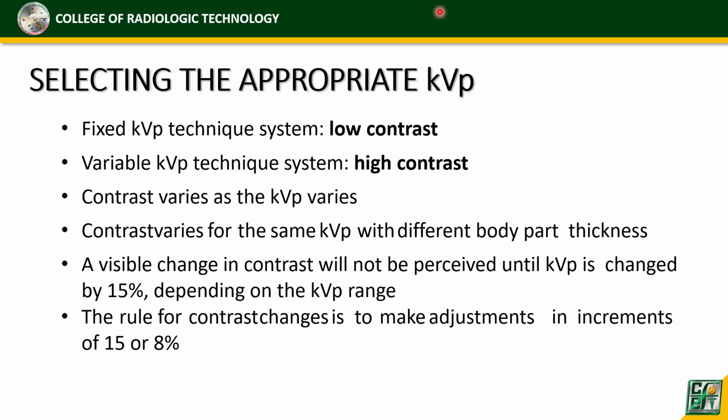Sir, hindi naman po in-expose sa X-ray. Yes, hindi siya na-expose sa X-ray. Saan siya na-expose sa radiation? Sa light. Di ba? Remember that our film nakalagay sa cassette, hindi naman talaga X-ray yung tumatama sa ating film, di ba?